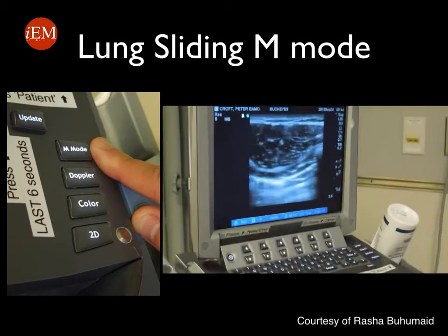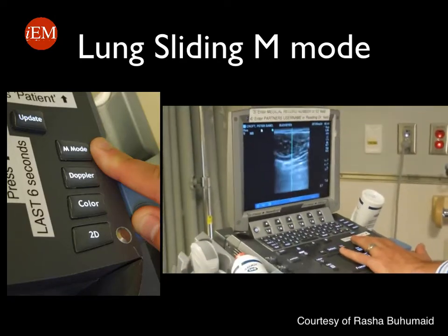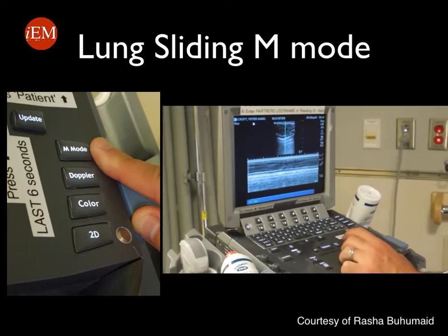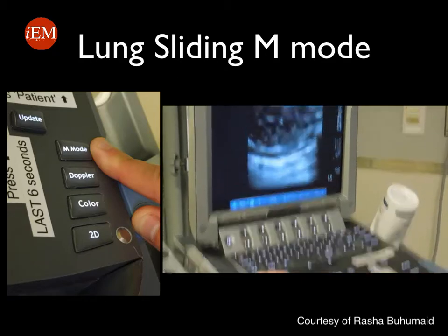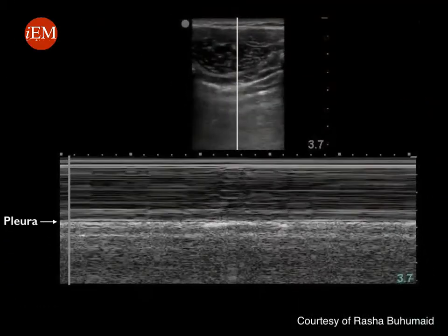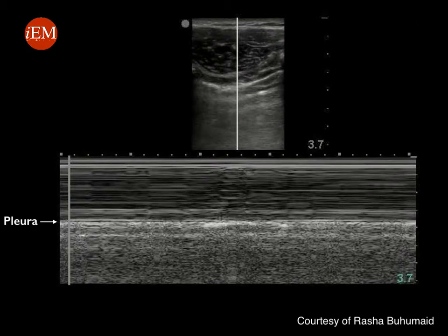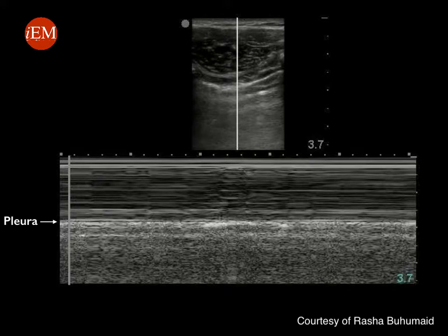You can also document lung sliding using M-mode, or motion mode. Using the M-mode cursor, place it just crossing the pleural line and click on M-mode again. The M-mode will demonstrate any motion that goes through the ultrasound cursor. This is the corresponding M-mode of a normal lung sliding.